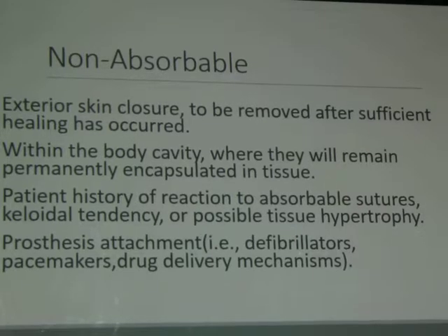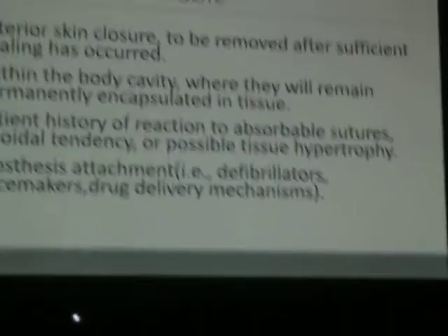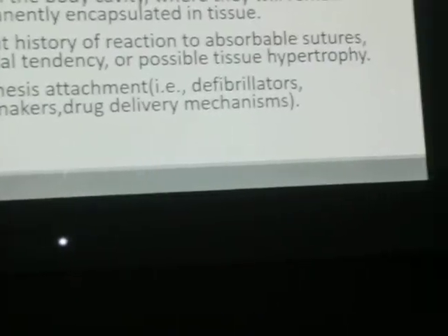That is why, often, when we are securing hemostasis and closing a big vessel, I use a non-absorbable suture. So I am quite sure that the suture will not slip, it will not dissolve, and I will not have delayed bleeding as well.